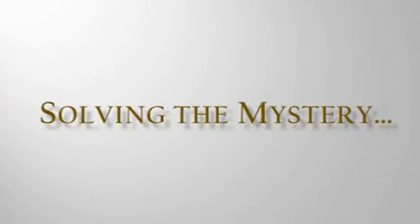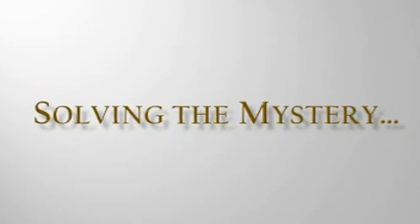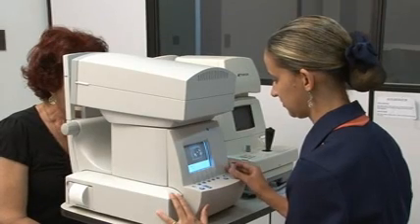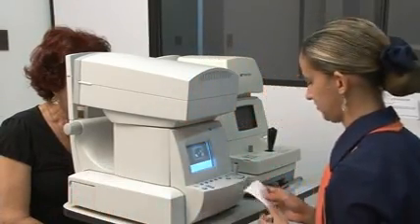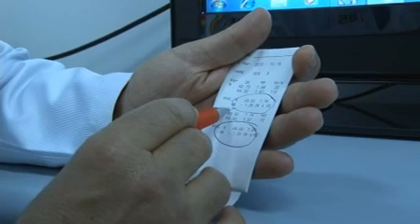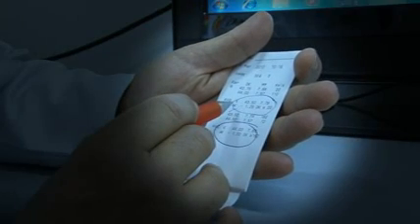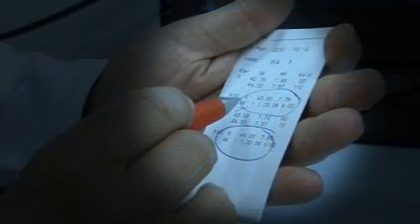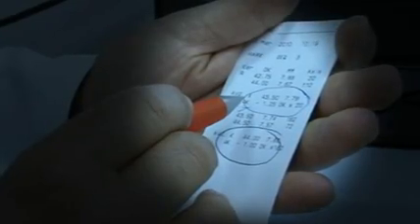Then, an apparently irrelevant detail gave us a starting point for our investigation. The central keratometric readings, obtained from the computerized keratometer, Humphrey Instruments, were nearly 1 diopter steeper than those from PENTACAM if applied on the SRK/T formula. This new data input yields an IOL power calculation 1 diopter weaker than the IOL power previously selected.